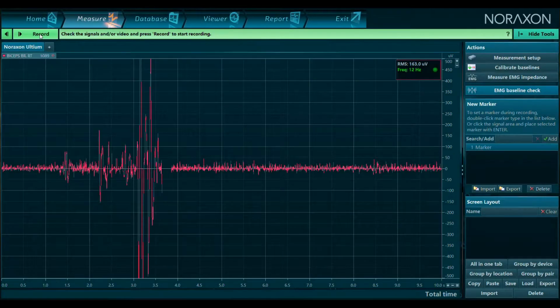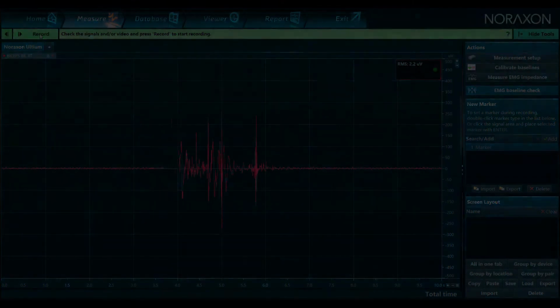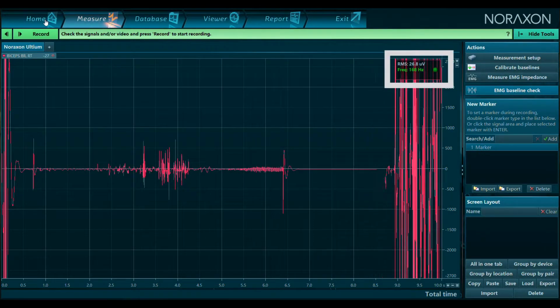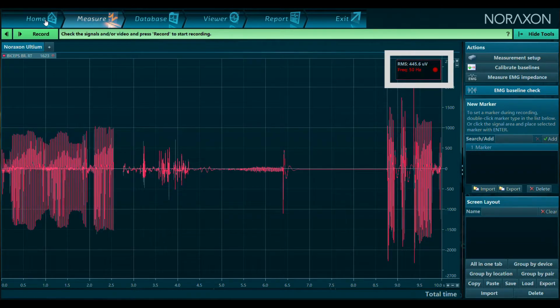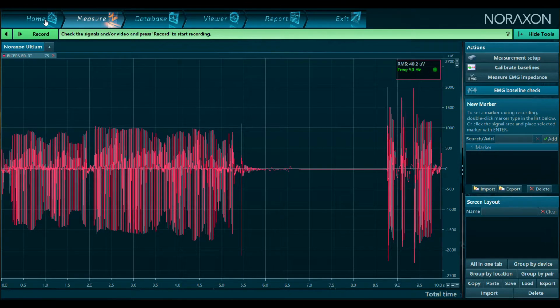Check your noise floor. It should be less than 3.5 microvolts. A high noise floor can be attributed to cable or other electromagnetic interferences. Check your signal for an electric hum. If you can see a signal with a constant frequency of 50 or 60 Hz, depending on your mains electricity frequency, you might have an interference from your power supply.